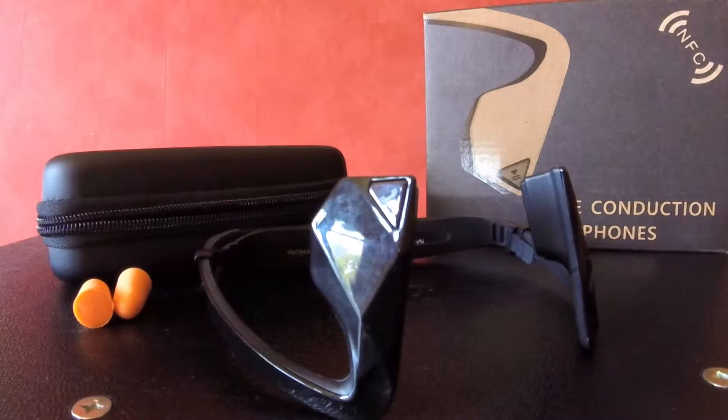Hi, I'm Tricia and today I want to talk to you about a rather cool headset from DigiCare. It's called the DigiCare Do. It's a bone conduction headset.